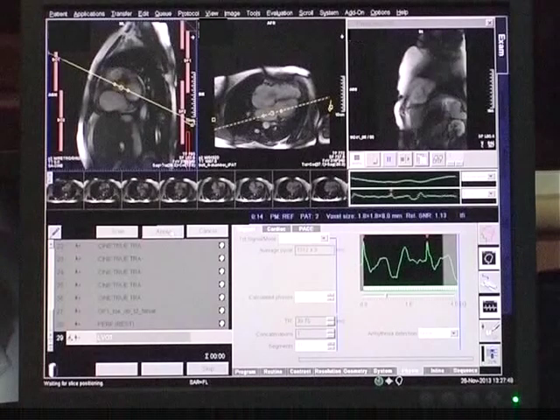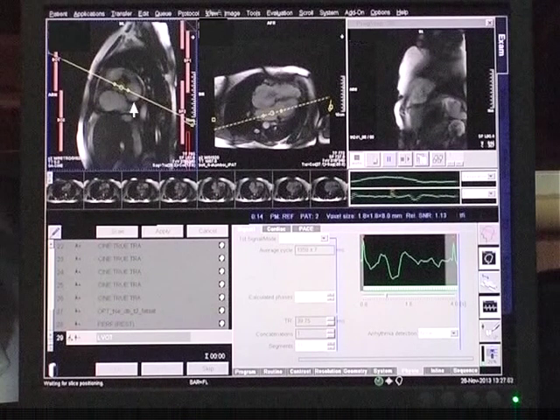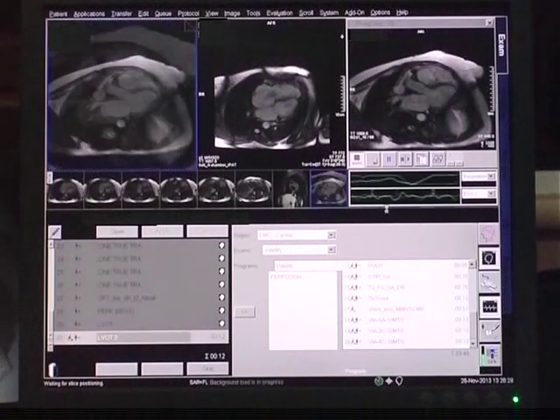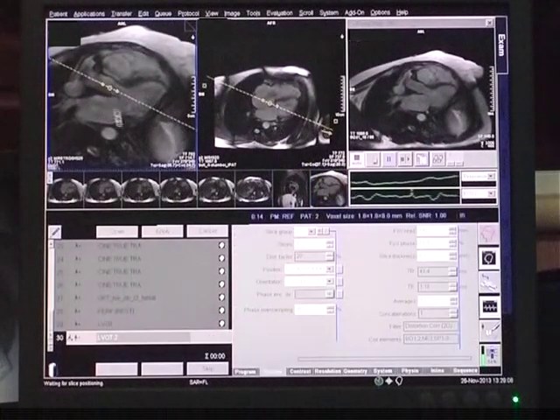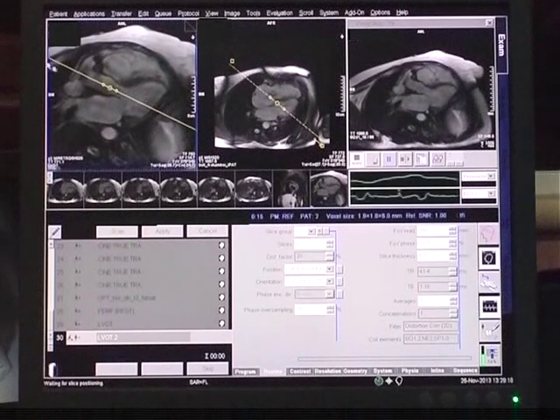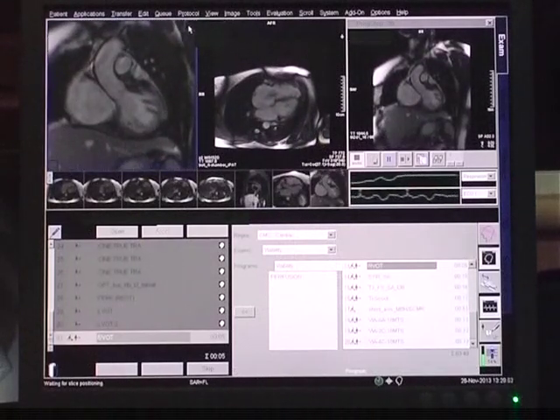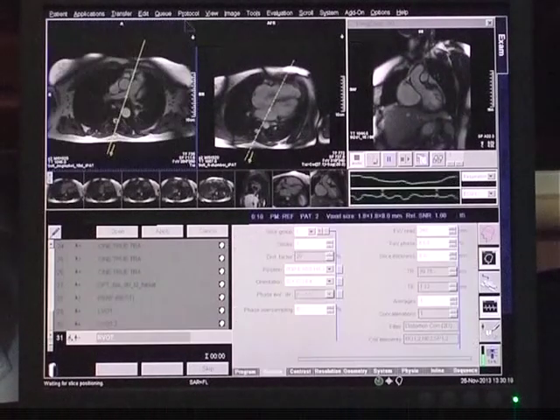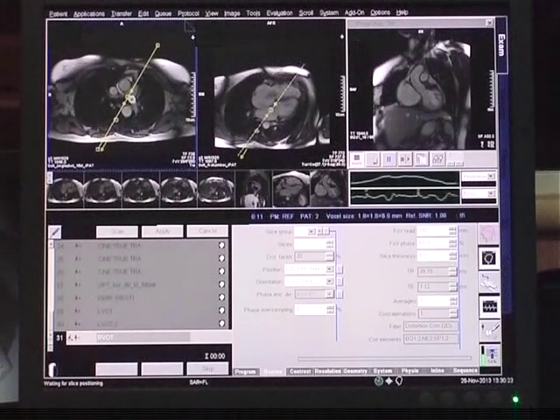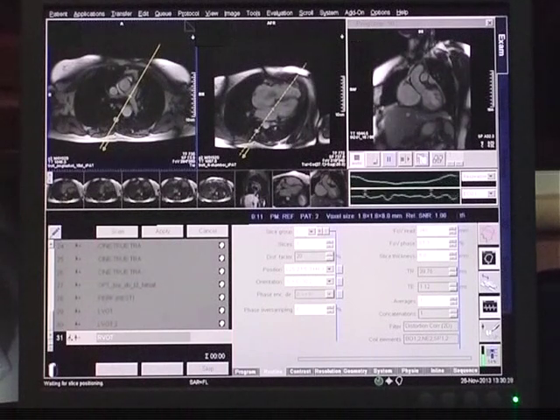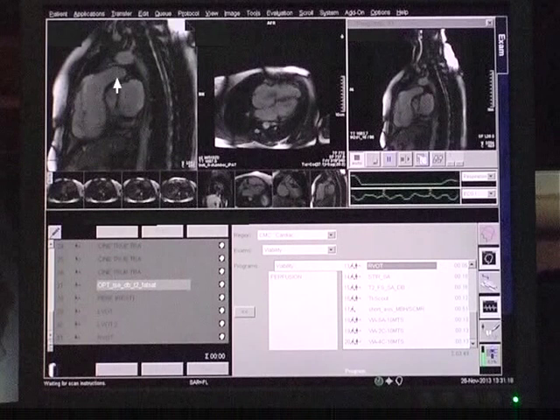For LVOT planning, a line is drawn through the center of the aortic valve and the left ventricle, showing the left atrium, left ventricle, and aorta. In the second LVOT view, a line is drawn through the aorta on the first LVOT view. For the RVOT view, on the true axial sequence, a line is drawn through the main pulmonary artery to obtain images of the right ventricle, RVOT, and main pulmonary artery.